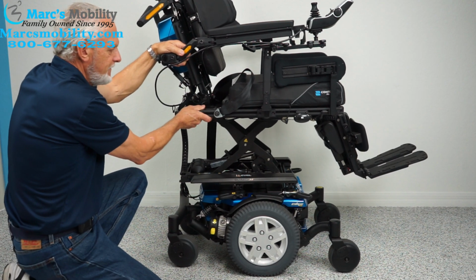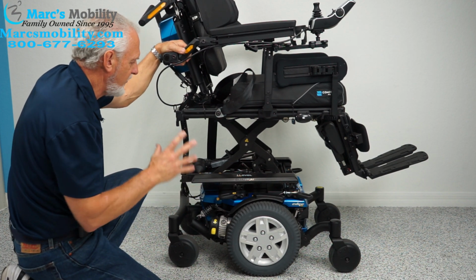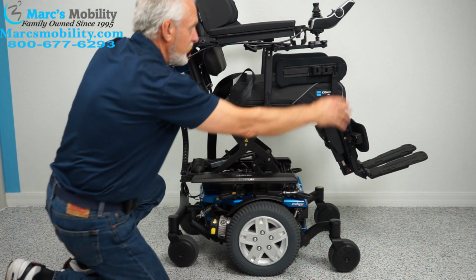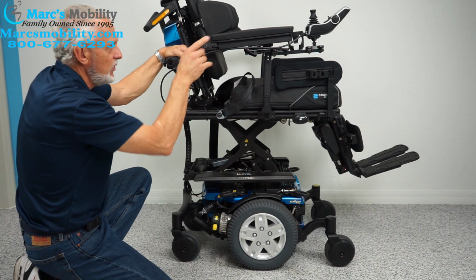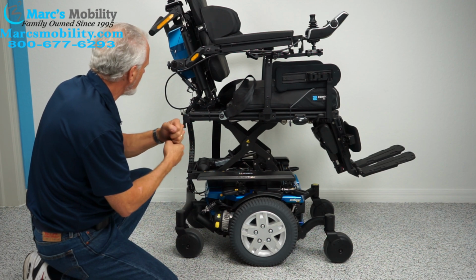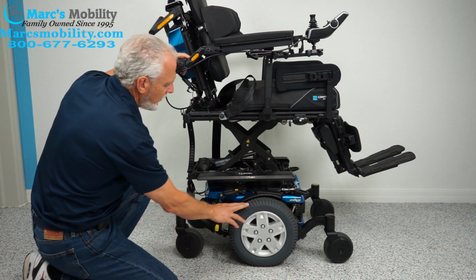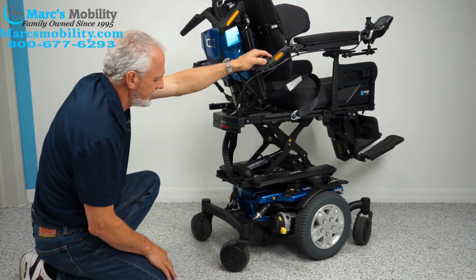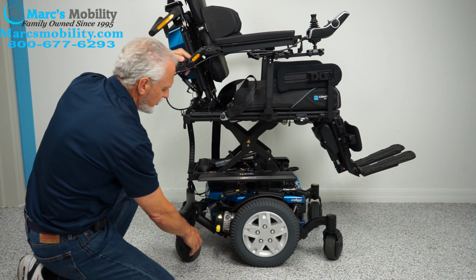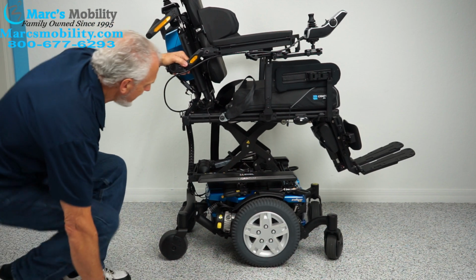If I want to push this chair, right now it weighs 450 pounds. So just to let you know, it's a heavy chair, 450 pounds because it's all metal and motors. If I want to push it, there's no way I could do it. But if I turn the power off, and the reason you want the power off on your joystick is you want no pullback on your motors, then you just push the yellow button down, and what that does, it unlocks your wheels. So you have to do both motors on both sides, and you can see how the wheel is unlocked now. When you're done though, make sure you put it back in gear so you can drive it again.